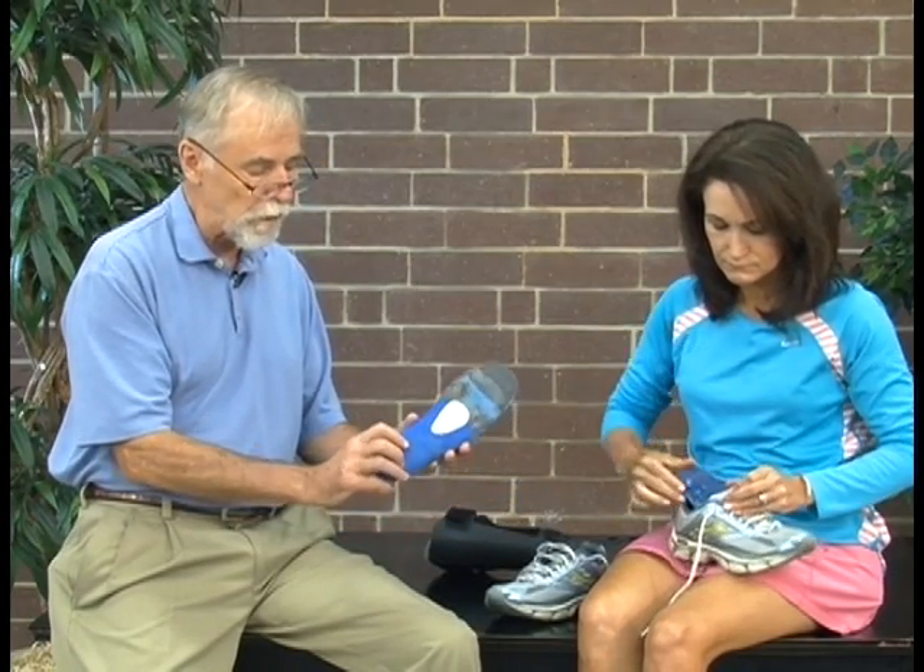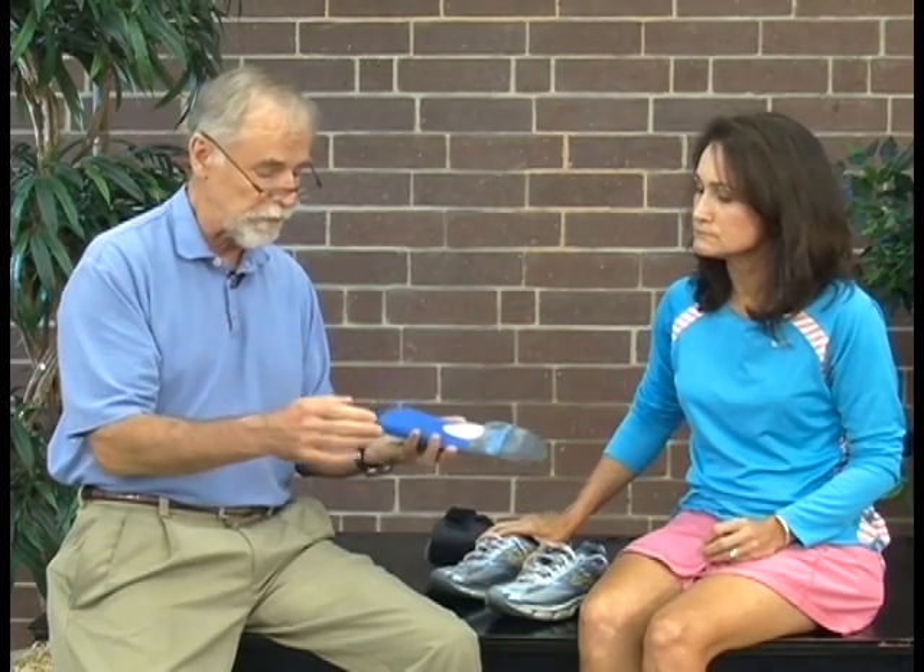On the brace side, as she came to more normal form, we found out she was getting pressure up under her forefoot, so we added a pad here to bring support for that. So this one has both a pad to support the forefoot pressure that she started getting after we corrected her running form, and also a lift that's built into the orthotic.